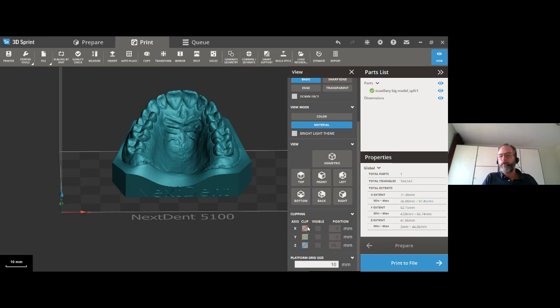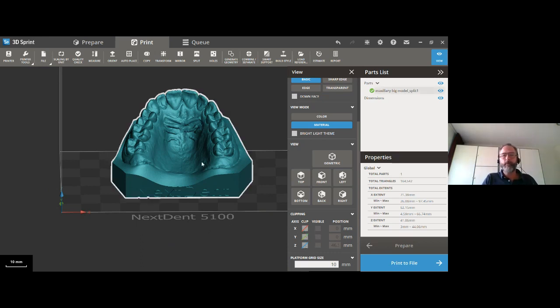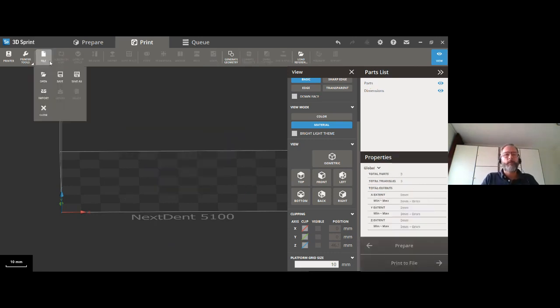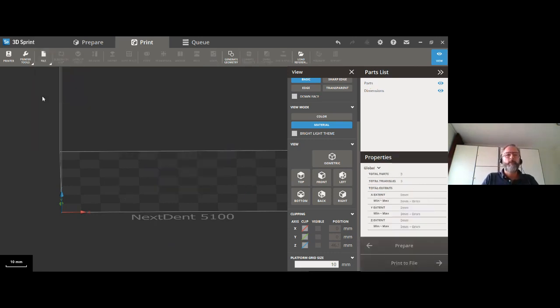For what we call the cupping problem, this is a great feature — look at the model using the clipping view, and by orientating it slightly differently you can overcome this small issue.